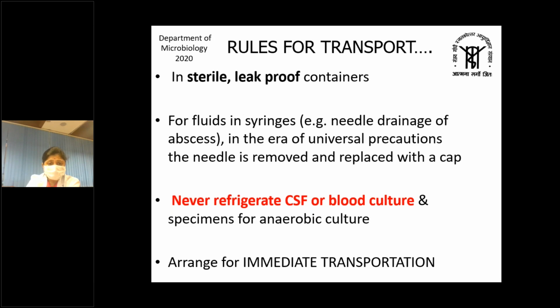For fluids in syringes, for example, when you are draining an abscess, then in the era of universal precautions, HIV and hepatitis B, the needle should be removed and replaced with a cap. Always remember that you should never refrigerate CSF or blood cultures and specimens for anaerobic culture. So if there is a delay in transport of cerebrospinal fluid or blood culture samples, then the containers or the bottles should be left at room temperature.